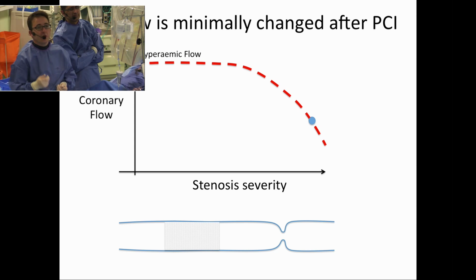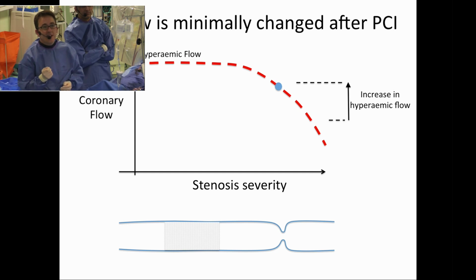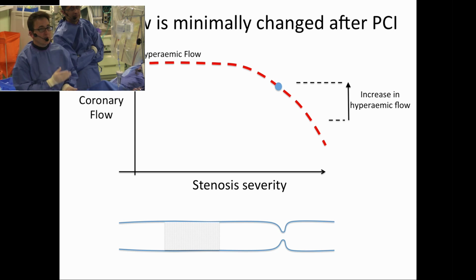And then what do you go and do? You put a stent in proximally, and then what happens to that flow? Because you've removed some of the obstruction to flow, the flow increases. Now if we go on, you can see that the flow's increased just by putting a single stent in there. If we were to leave our pressure wire down distal to that last stenosis, with the increase in flow, and remember it's the increase in flow which determines the severity of the FFR measurement, the FFR may be the same, or it may even be worse because the flow has actually increased.